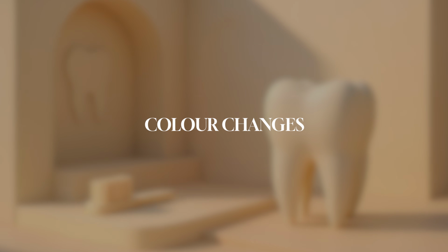The next technique that can help you locate calcified canals is observing color changes within the tooth. When we say color changes, we are talking about the difference in color between the calcified portion of the canal and the adjacent monochromatic dentin. So we can use color changes as a guide to locate calcified canals. Let's have a look at how this is done.